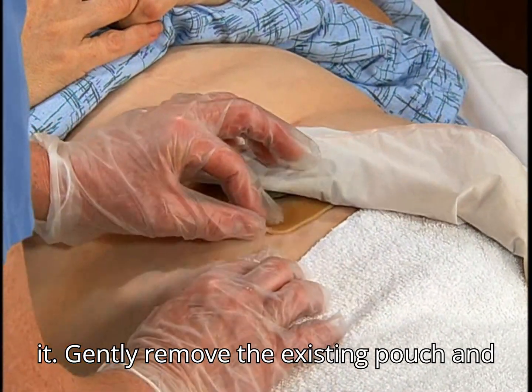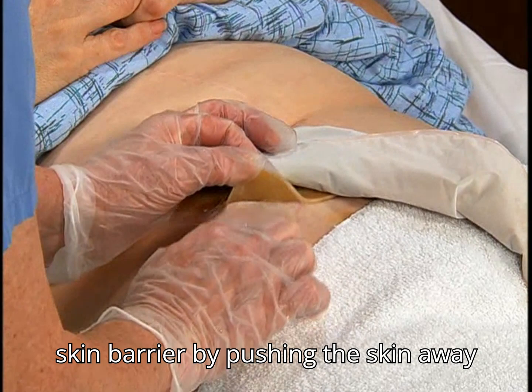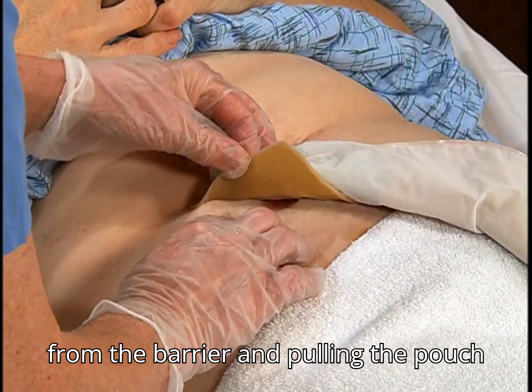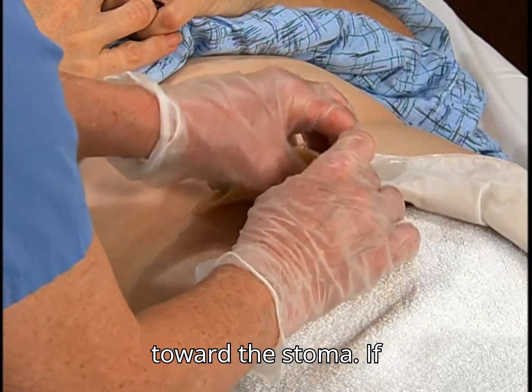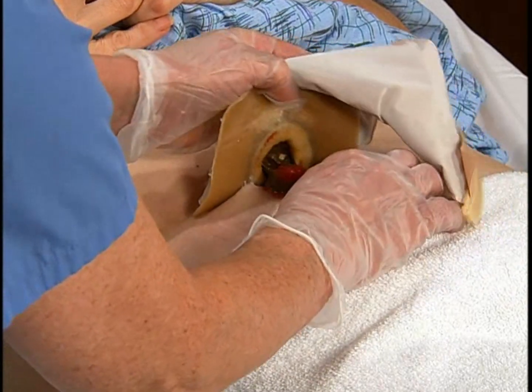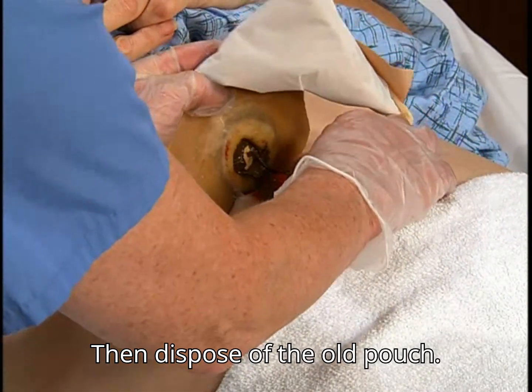Gently remove the existing pouch and skin barrier by pushing the skin away from the barrier and pulling the pouch toward the stoma. If needed, use an adhesive remover. Then dispose of the old pouch.